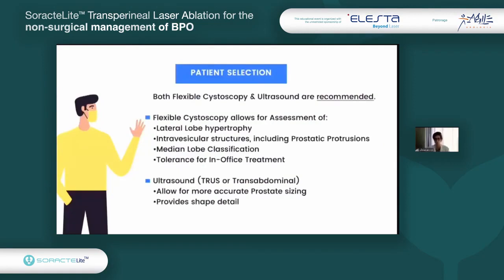To select the patient, of course, we have to perform the uroflow, the PSA, anamnesis, and so on, but we suggest also performing a flexible cystoscopy and an ultrasound of the prostate. It can be a transabdominal or transrectal ultrasound, but we have to know the prostate in terms of dimension and shape, and whether there is any kind of stenosis or something that can make the procedure difficult. We have to collect as much information as we can to be sure that the procedure will have no complication and no contraindication. The fact that the patient uses anti-aggregation or anticoagulation medication is not a problem. We can perform it as well.